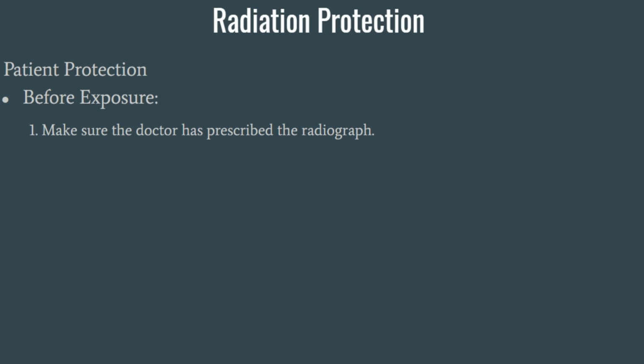And keep in mind that different conditions have different needs. So you may have an emergency patient on the schedule, but it doesn't necessarily mean that they are required to have an x-ray. There are some things that the doctor can see clinically without having that exposure to radiation. So this is where it's important. Make sure the doctor has prescribed that radiograph.